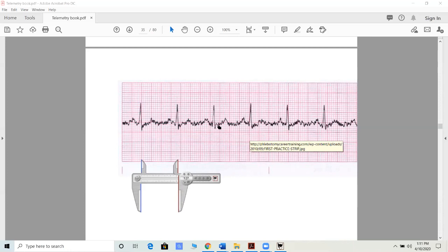And you're probably wondering where I got the 250, right? So if we took our 1500 and divided it by 19, we got 78, okay? So 19 times 78 is approximately 1500, right? So if I have 250 and I want to find out what the distance is in my atrial rhythm, we said our heart rate for our atria was 250 beats per minute.